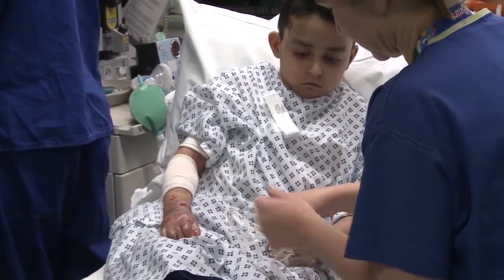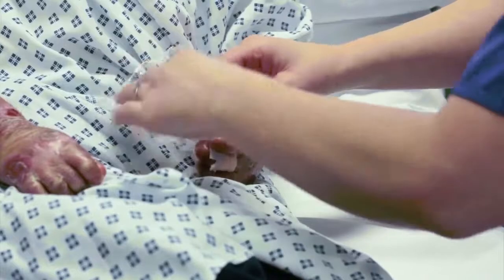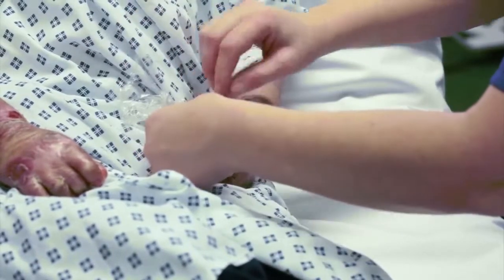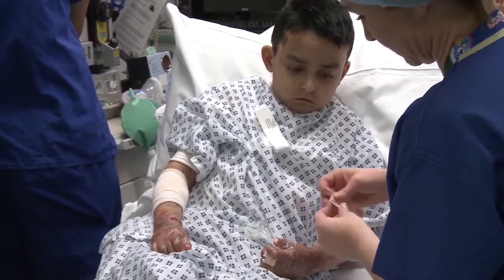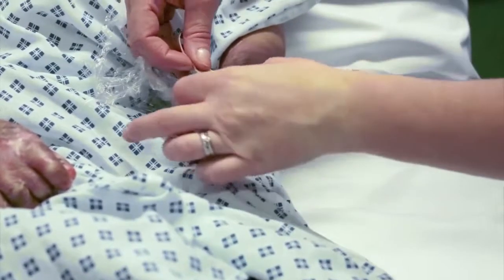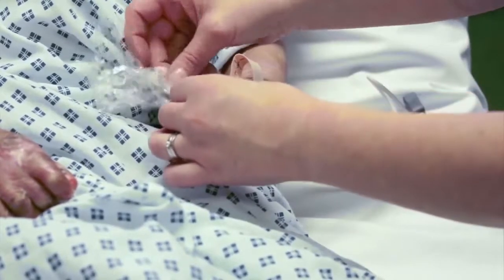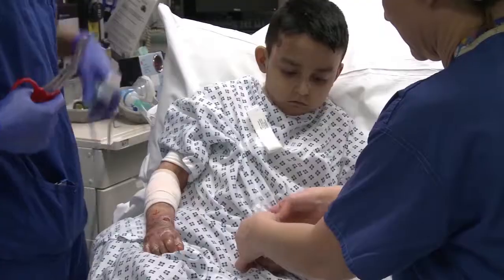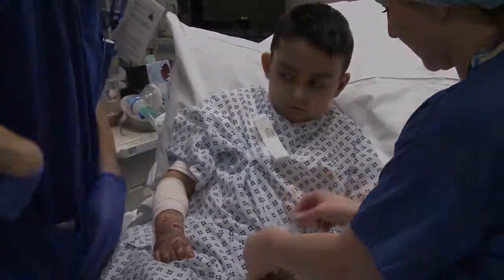Before we start though, we shall ensure essential monitoring is established. Cling film is used to wrap around the finger and the adhesive oxygen monitor is placed on top. The infrared light of the monitor is not disrupted by the cling film, which prevents the sticky probe from injuring the skin upon its removal. This is being demonstrated by the patient's EB nurse, who accompanies the patient to theatre in order to advise the theatre team on the best dressings for each individual, and also ensures that theatre staff who may occasionally encounter patients with EB are supported.